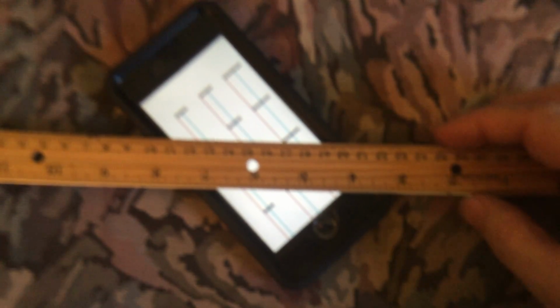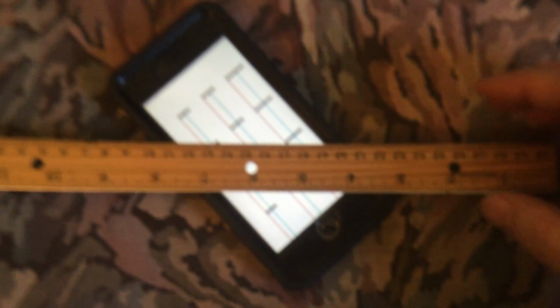but our goal is to actually align the phone along the astigmatism axis so that we can acquire an astigmatism axis in degrees. We do this by placing a ruler exactly horizontal to us, and then rotating the phone towards the vertical without moving the ruler at all until the ruler is exactly vertical, which realigns our phone 90 degrees to be along the astigmatism axis. And at this point, we can scroll down to the astigmatism axis line and determine our astigmatism axis in degrees.